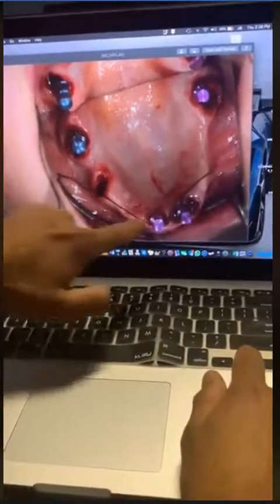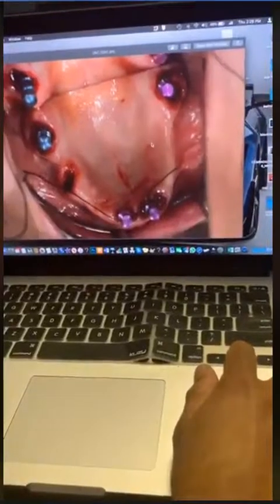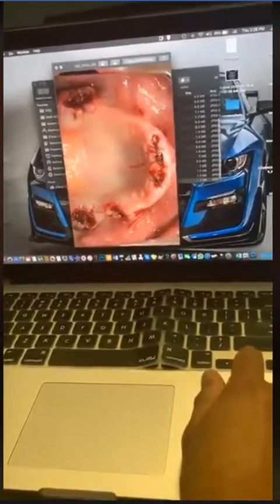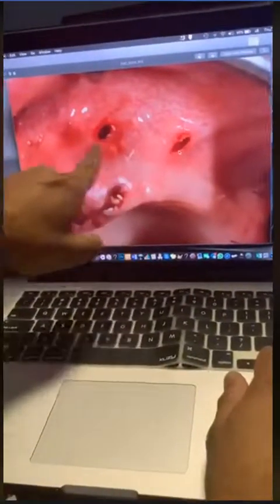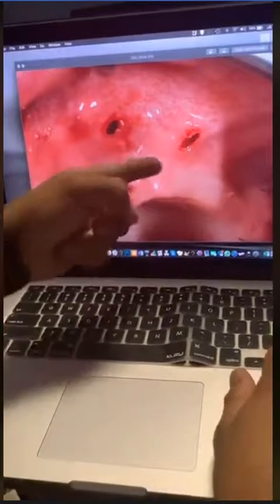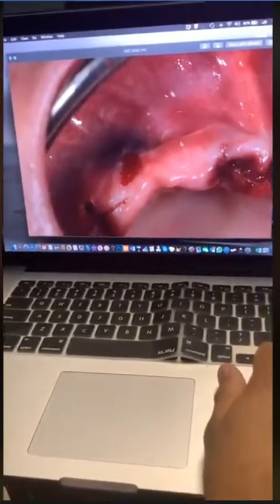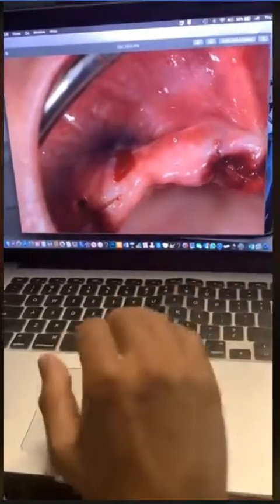Now here are the paralleling pins that you could insert on top of your implant to check your parallelism with an MIS implant. Okay. You bone graft the sides and you get out and suture and done. Easy. Just wanted to show you some of the sites where we put those fixation pins into the patient. I don't even suture this. This will heal very easily without any problem for the patient. There's another one on this side, okay? So there's one on the right side, and two on the left side. You could put as many as you choose, okay?